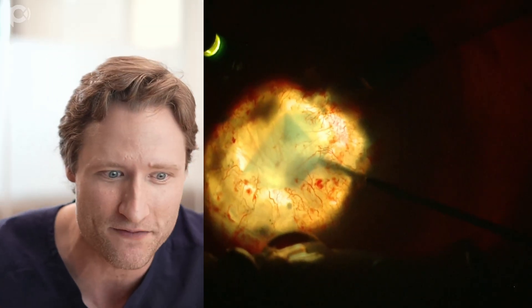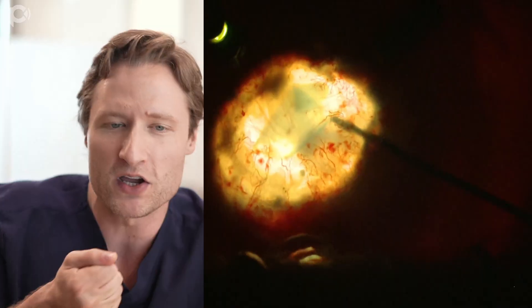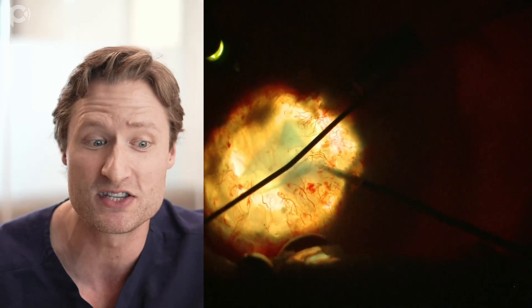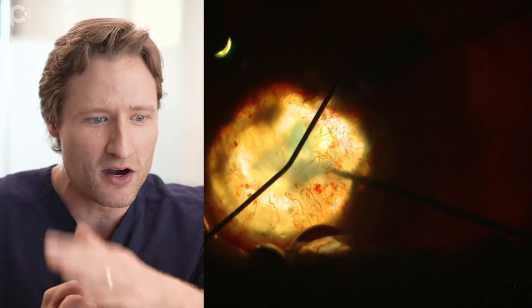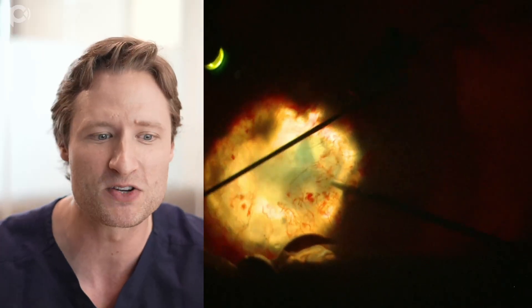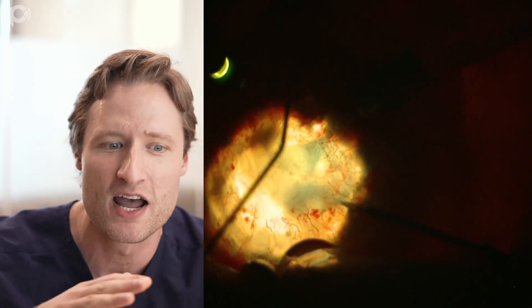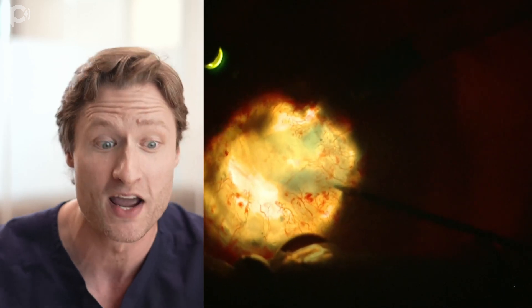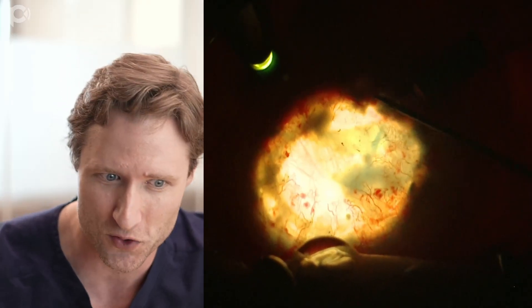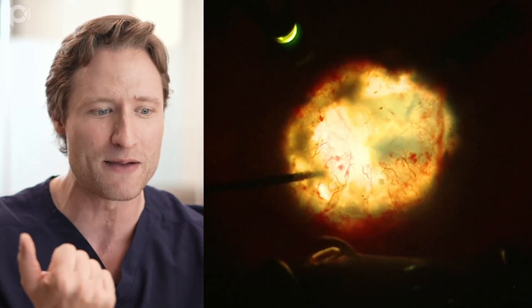So you can't unfold the graft. What I'm trying to do is reach in with coaxial forceps to grab the graft and pull it over towards me. If I can pull that folded edge more into the center of the anterior chamber, that's where it's deepest. I'm placing taps on the surface of the cornea to iron that edge of the graft out, facilitated by the anterior chamber maintainer pumping fluid in to deepen the chamber. And we've had some success - the graft is definitely better unfolded - but there's still a lingering inferior edge that remains flipped over.